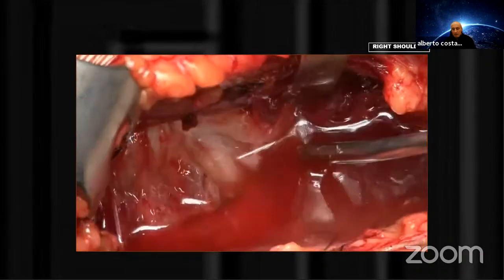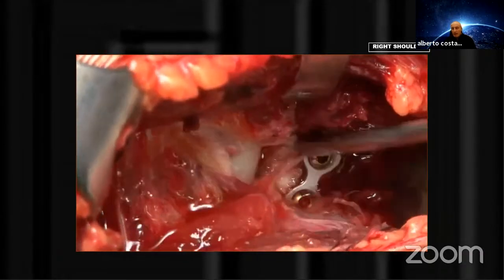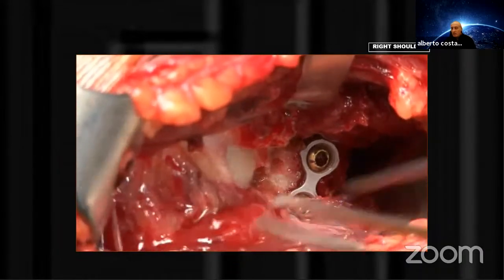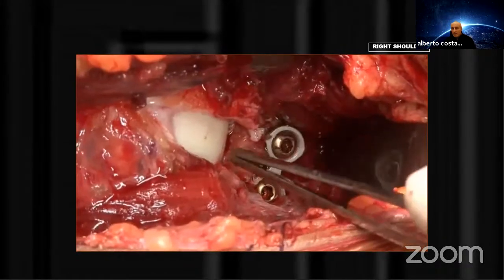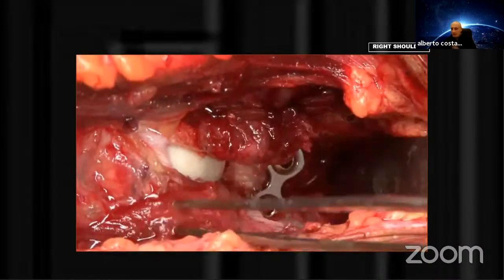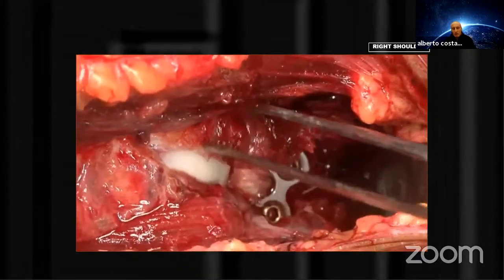We can obviously close the capsule, we give two points to the capsule and subscapularis together, and we close, and we don't see any difference in retraction, in abduction, external rotation, any problem with the ROM. And we see that we close easily.